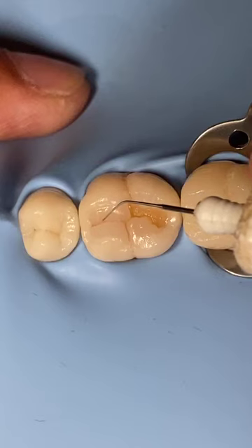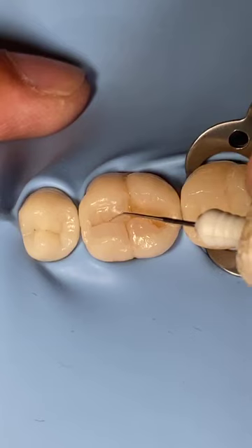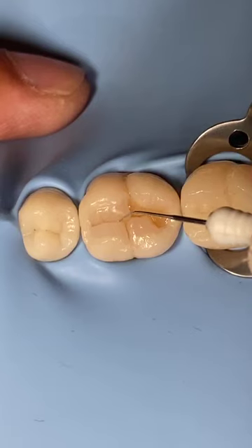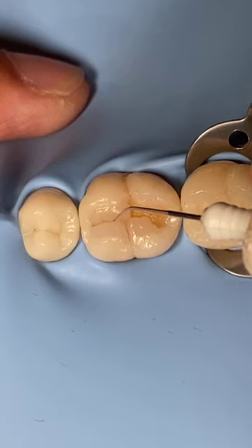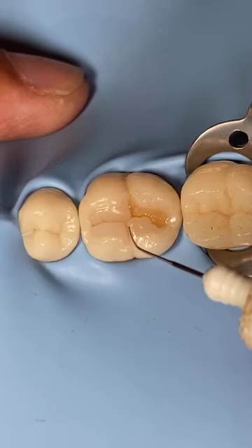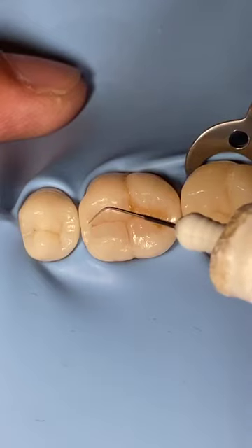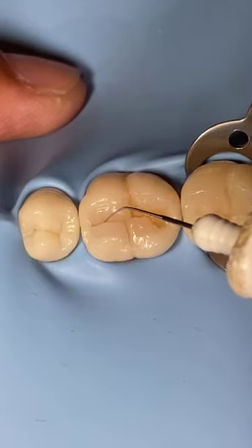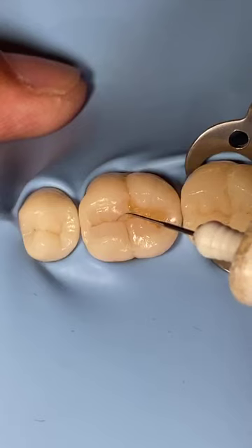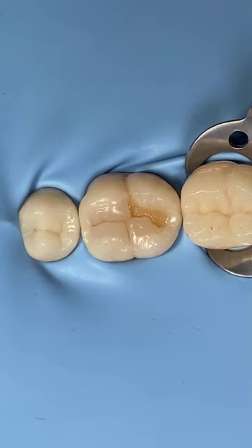And just remember, it's even easier if you have magnification. It's very fun to do restoration if you have magnification. See, until all the gaps are really, really obvious. Don't stop until the gap is very obvious. See, now you have a big gap.